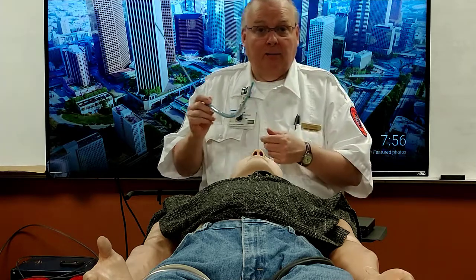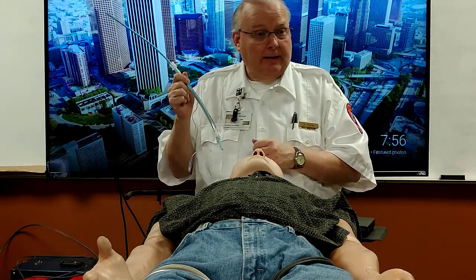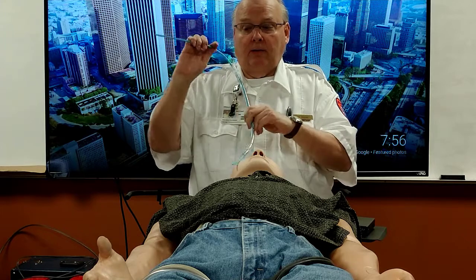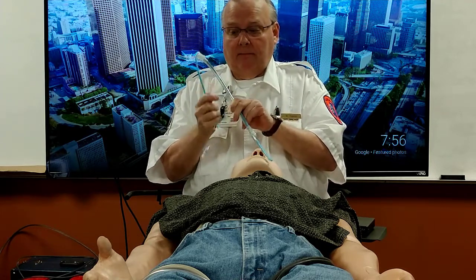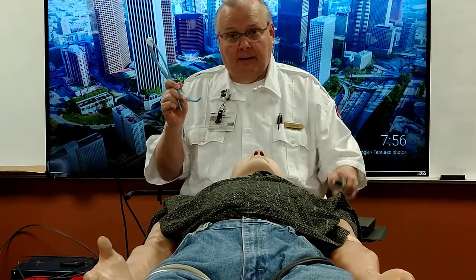You'll notice you have quite a bit sticking up here, and as you are introducing the tube and the bougie, that can sometimes get in your way and want to hit you in the face. One of the things you can do to better control the tube is to double the bougie over with the tube like this into your right hand.